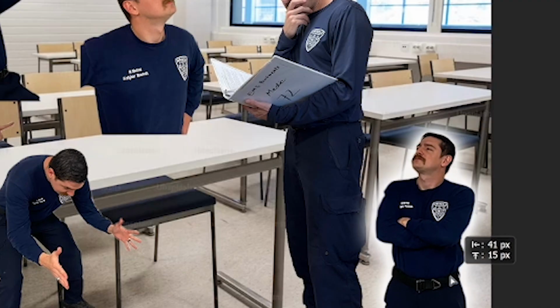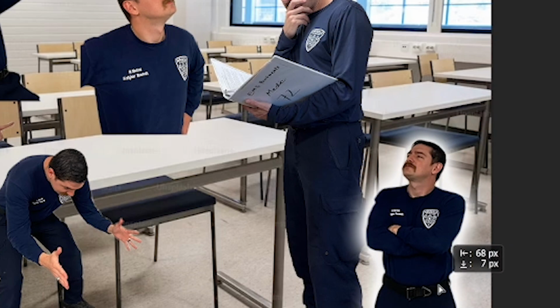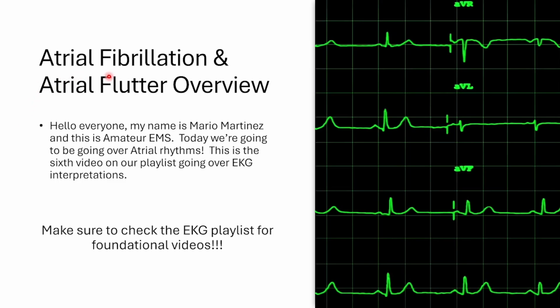Fellas, don't panic. I'll teach you all about a-fib and a-flutter. Alright guys, so we're gonna be going over a-fib and atrial flutter. My name is Mario Martinez, and this is Amateur EMS. This is going to be the 6th video on our playlist going over EKG interpretations. Make sure to check the EKG playlist for some foundational videos. It's really going to help you move along through this video, okay?